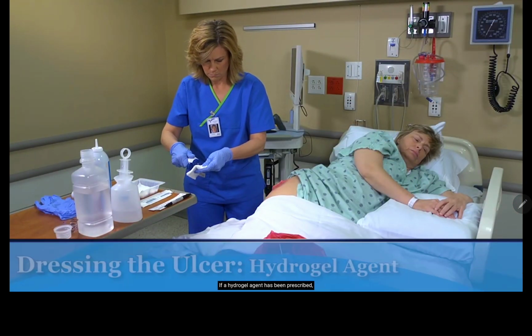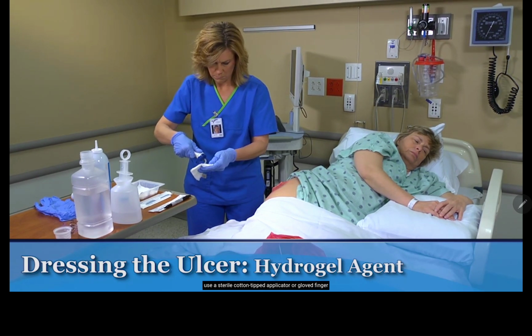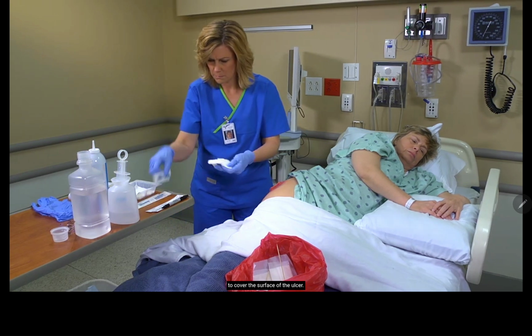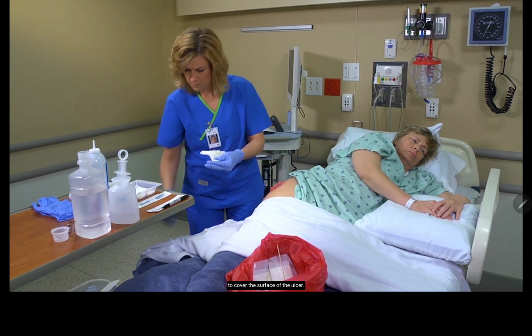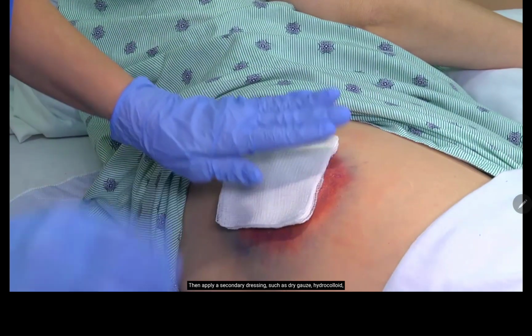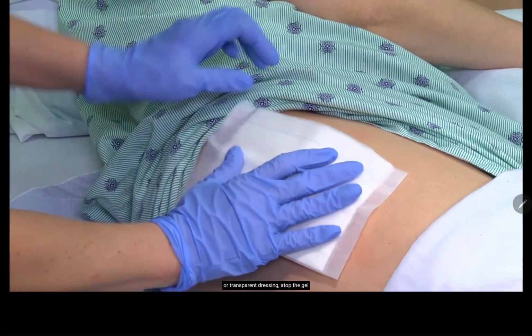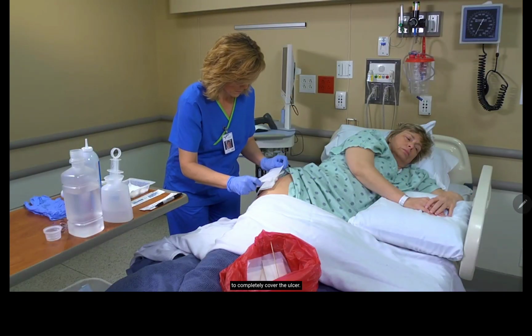If a hydrogel agent has been prescribed, use a sterile cotton-tipped applicator or gloved finger to cover the surface of the ulcer. Then apply a secondary dressing, such as dry gauze, hydrocolloid, or transparent dressing, atop the gel to completely cover the ulcer.